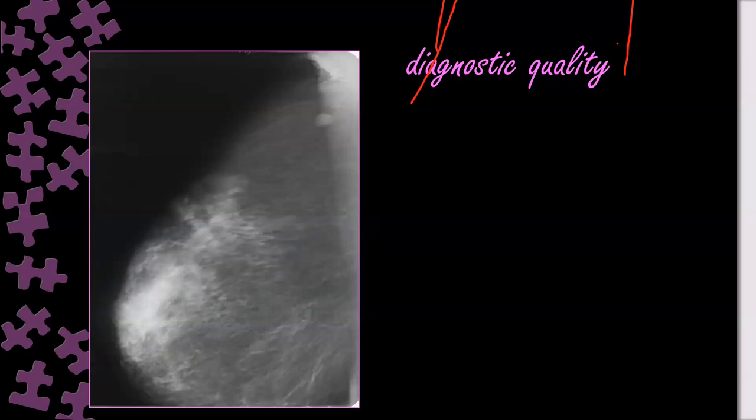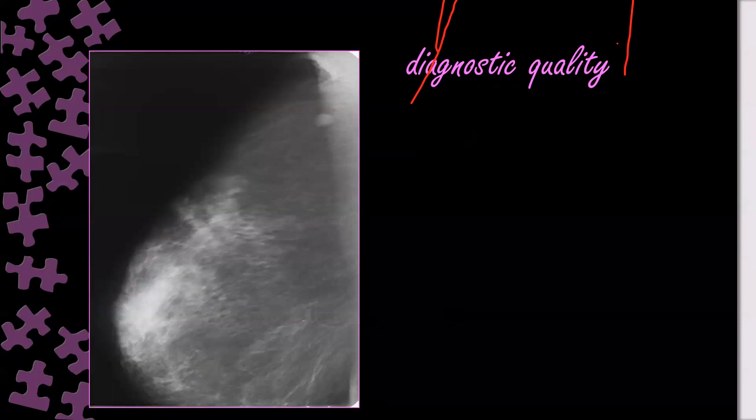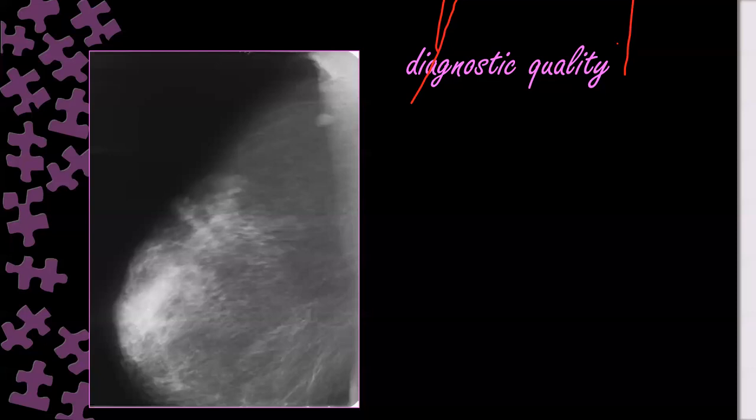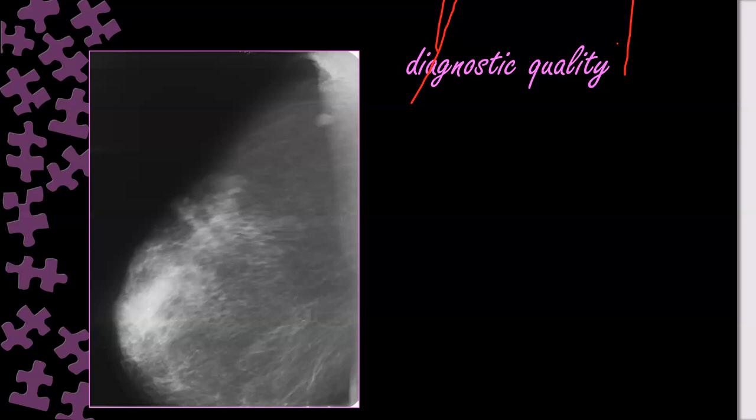What is the fault here? The inframammary line, the malposition, is one issue. What else, apart from malposition? Missing part of the contrast. Poor contrast also. More than poor contrast, or exposure. What about compression also? Why? Result in what? If you look more carefully, you see the condensed parenchyma retroareolar. Okay. What else? As if you have seen the lines double.